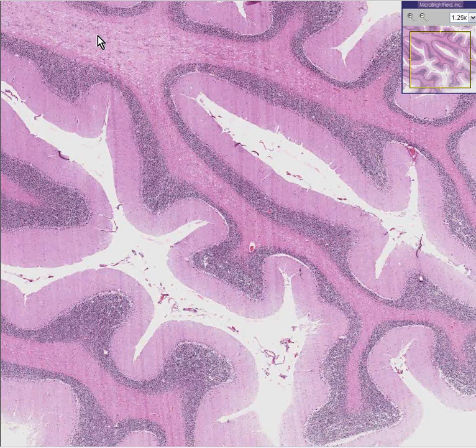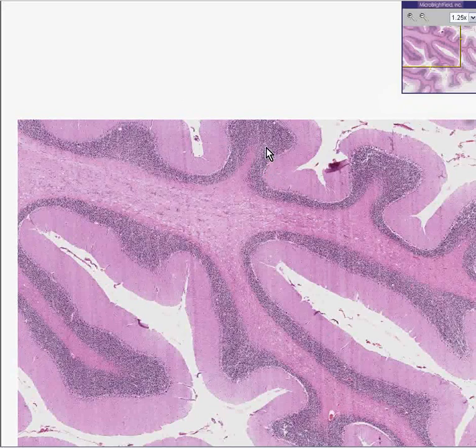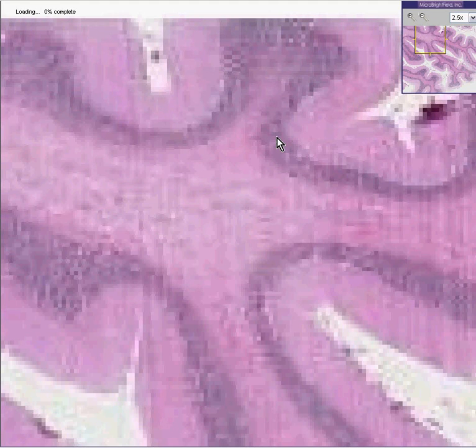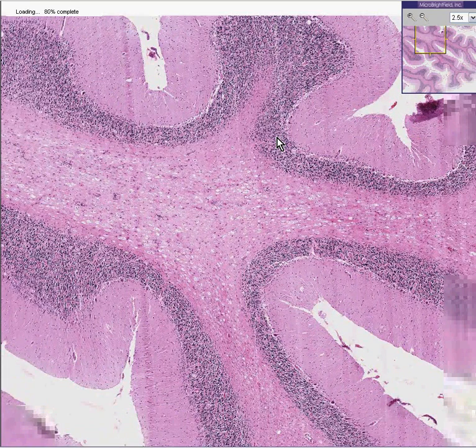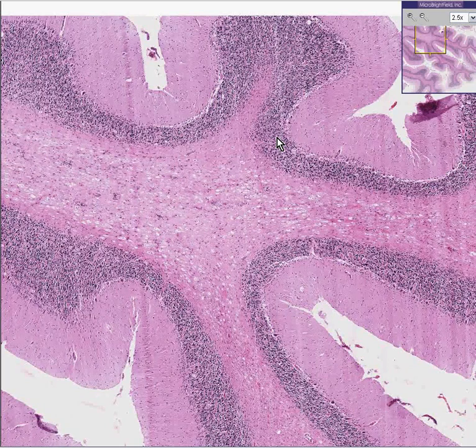This is absolutely classical cerebellum, but it's not normal cerebellum, and I'll tell you why. The concept of demyelinization or defective myelinization or absent myelinization is a very, very common concept, secondary to many, many nonspecific CNS diseases, of which the multiple sclerosis family is the biggest single variety, but demyelinization occurs anywhere.